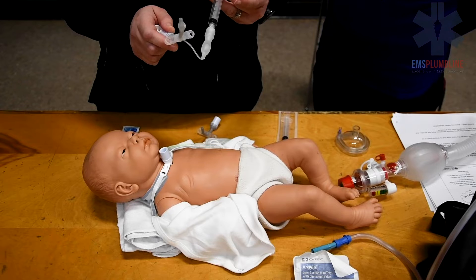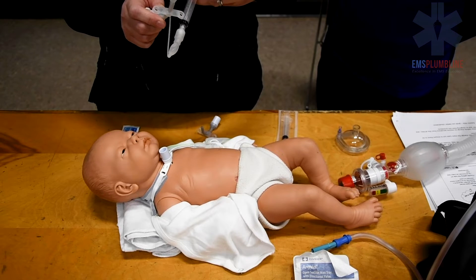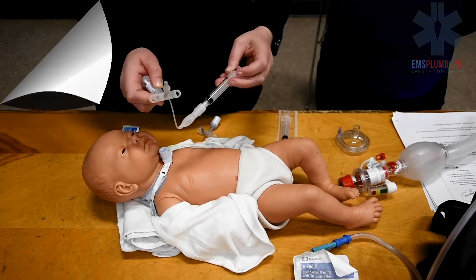After performing your cuff check, ensure you fully deflate the cuff. To determine the cuff volume, ask the child's caregiver. Water-based lubricant is used to make trach tube insertion easy.